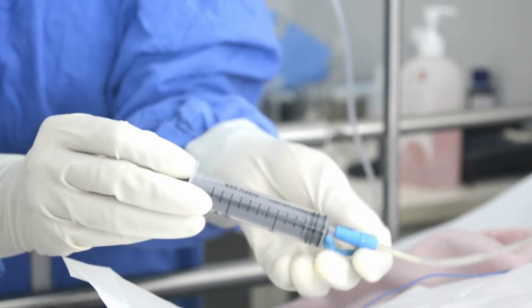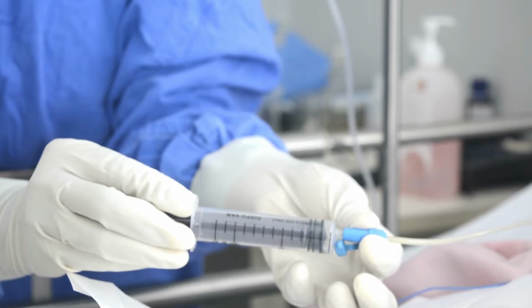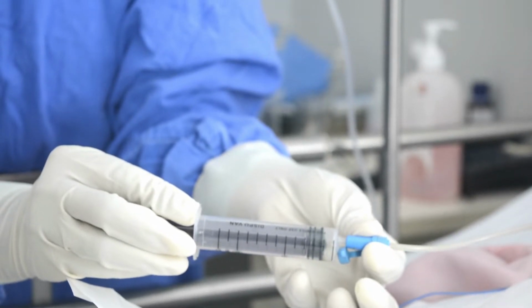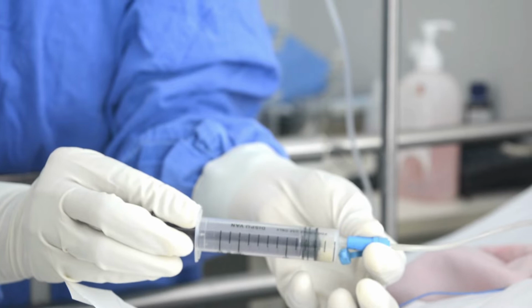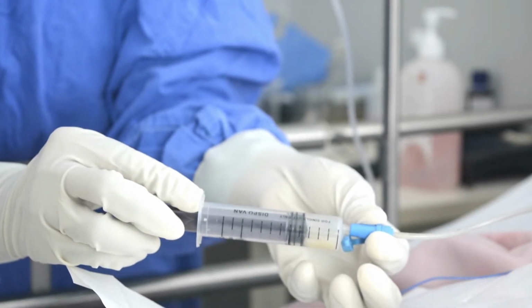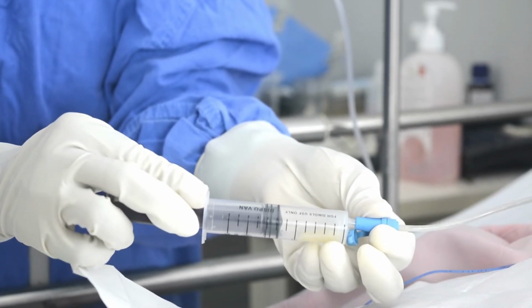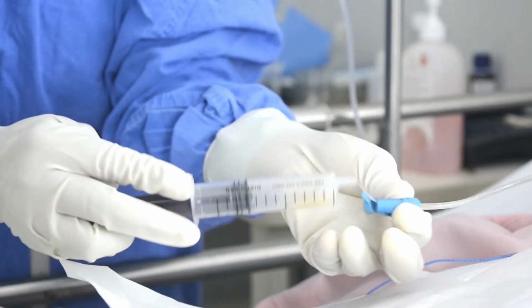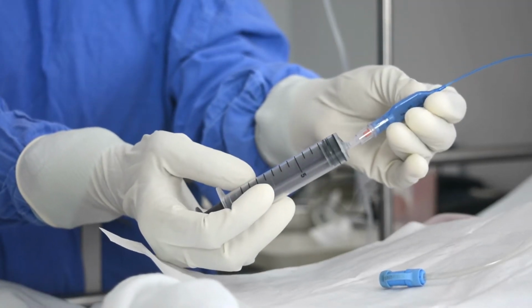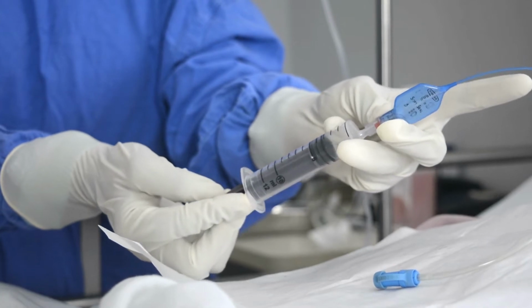Now we are clearing the secretions through the suction aid. This has to be done each time before deflation, or if the doctor has asked for corking, then also we have to remove the secretions like this. This is done before deflation. Here she is deflating. If any liquid is coming out, just expel it.